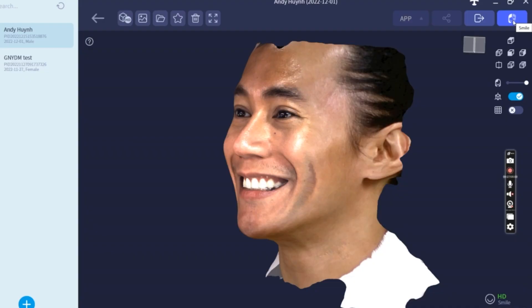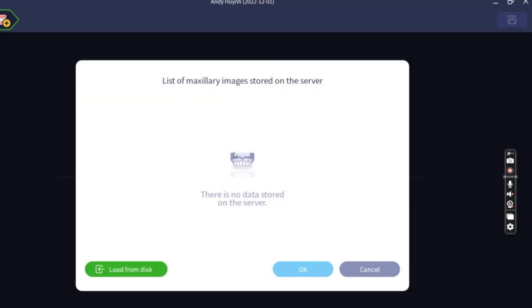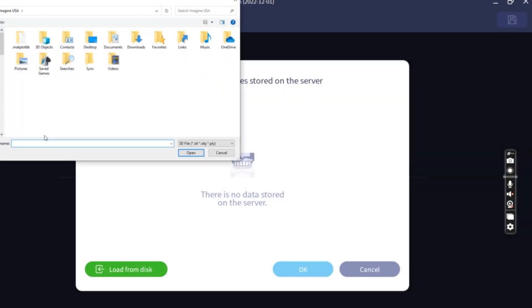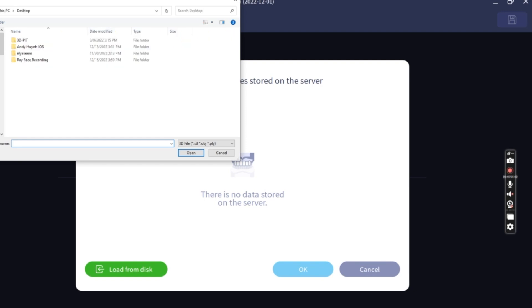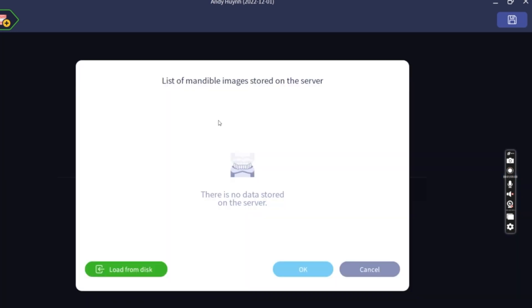To do that, we're going to click on the smile icon in the top right-hand corner of the screen, and now we have a bunch of different options to align different types of scans to the RayFace face scan. I'm going to go ahead and click on the upper model, and we're just going to load that directly from the computer. And then we're going to load in the lower model.